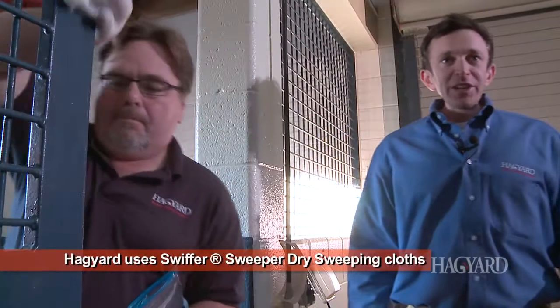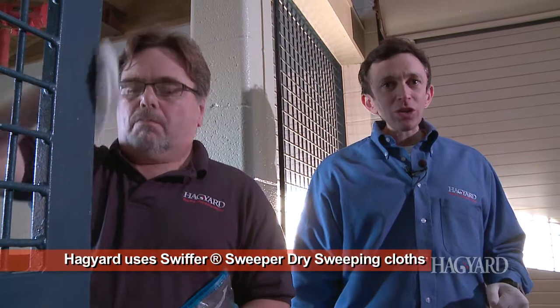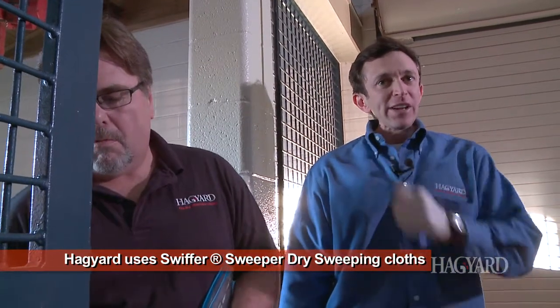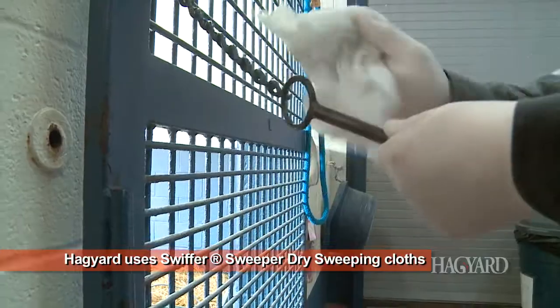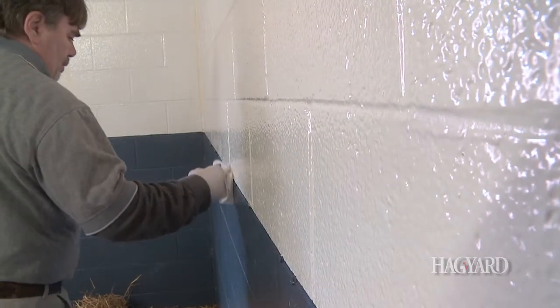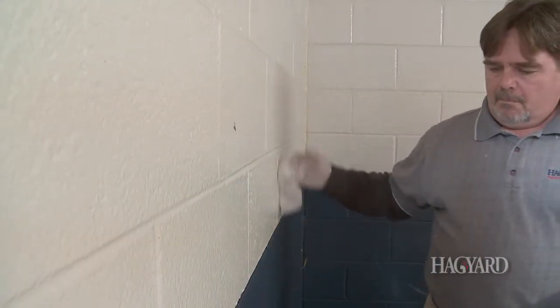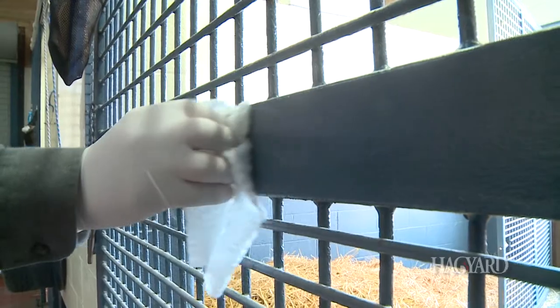So another important aspect of our biosecurity program is active surveillance. What I mean by active surveillance is environmental cultures like Chris is doing right here, making sure this stall is clean of salmonella, because that's what we worry about in our hospital. And at the same time, we do active surveillance on our patients here. Depending on your patient biosecurity level determines how many fecal cultures we do on our patients while they're here being treated medically. And we look for salmonella, as again, it's one of the most common hospital-acquired infections in our area.